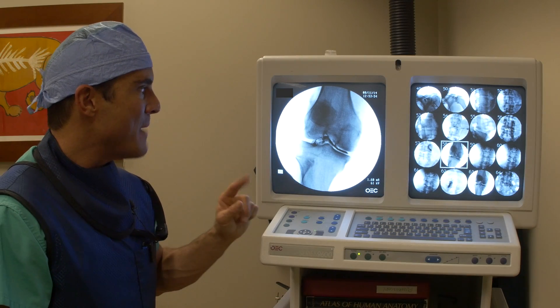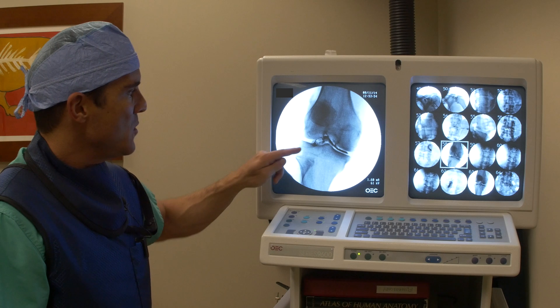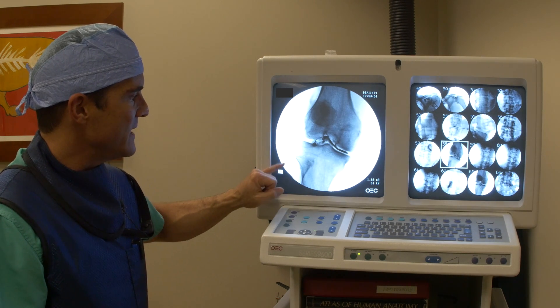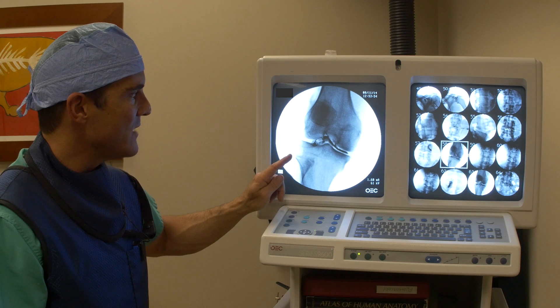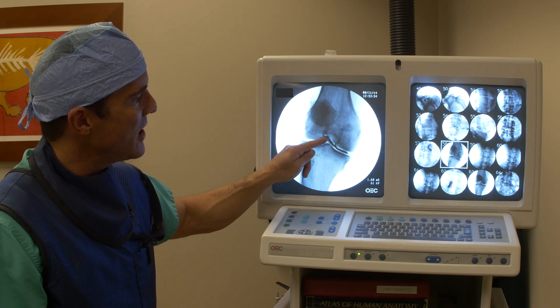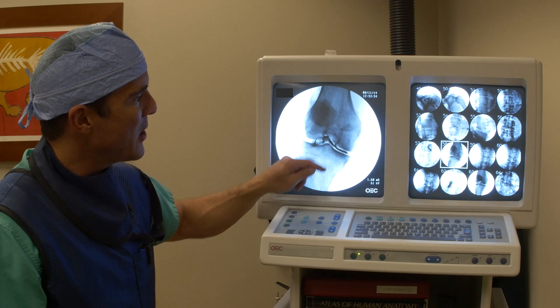This is an example of a proper knee injection. The needle is a little bit to one side, a little to the outside. This is the fibula here, so we know this is the outside. I inject a little contrast and we can see the contrast travel up and through all the compartments of the knee.